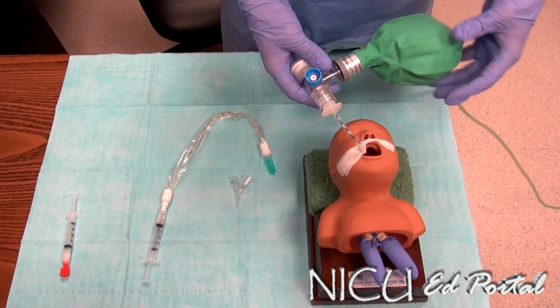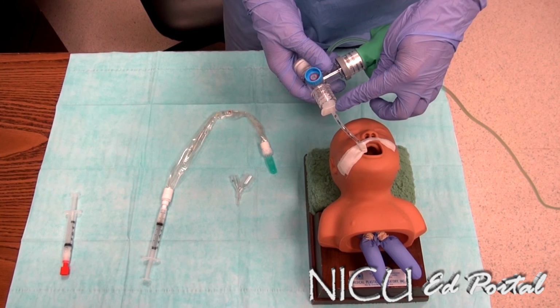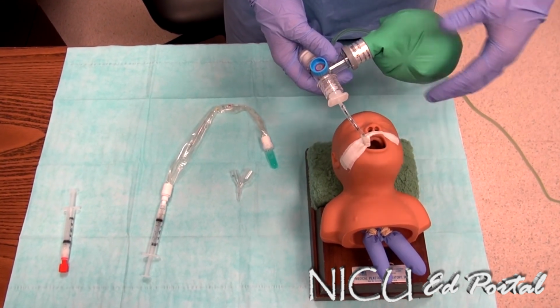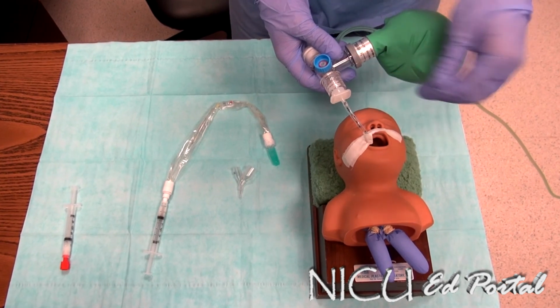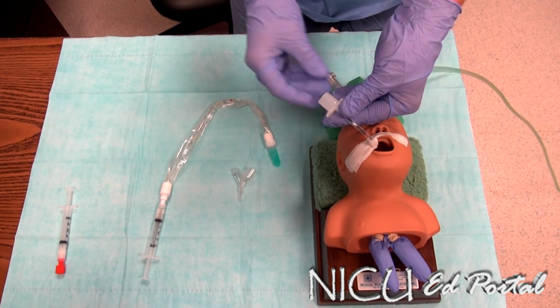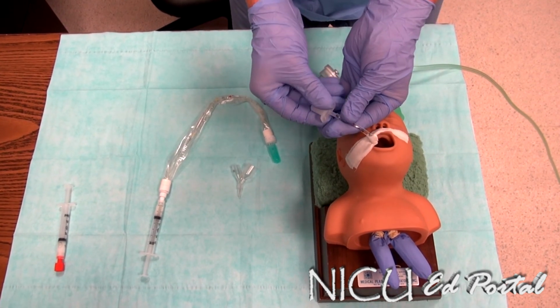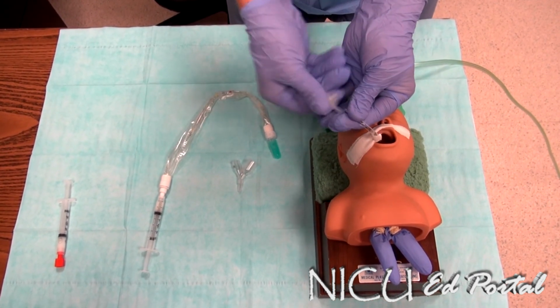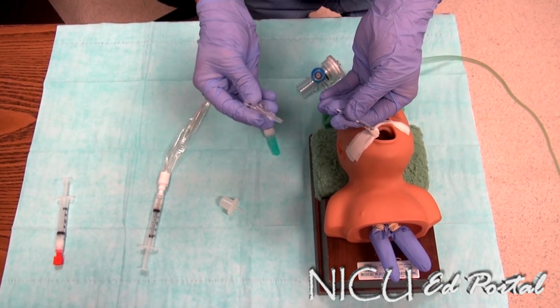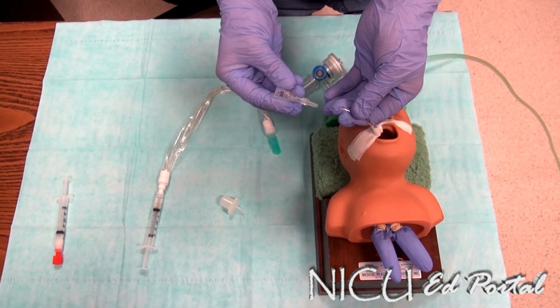So we have the stock adapter that comes with the ET tube currently in place. What we will do is we will disconnect the bag. We will remove that adapter. We will take the 3.0 adapter that comes in the kit.